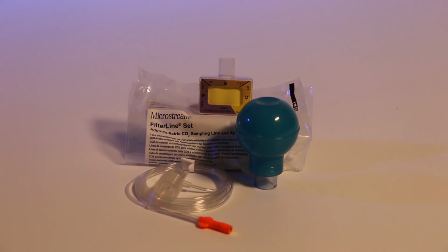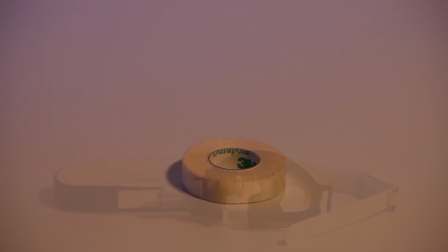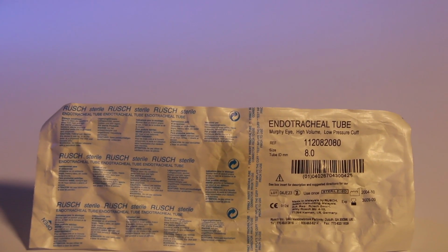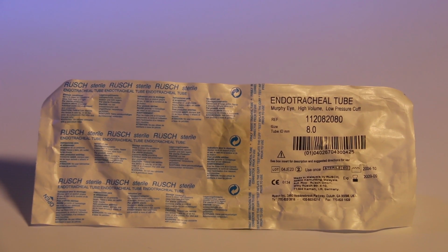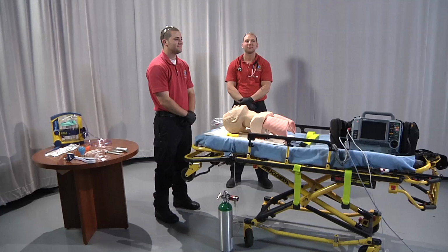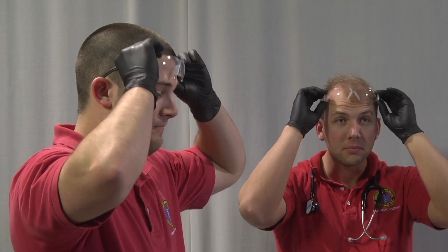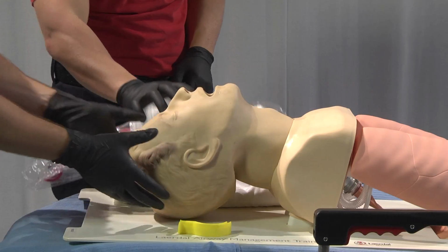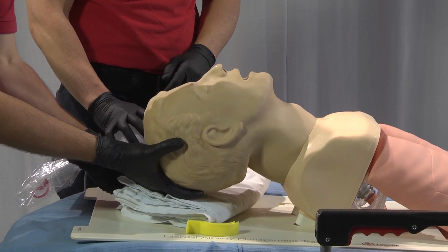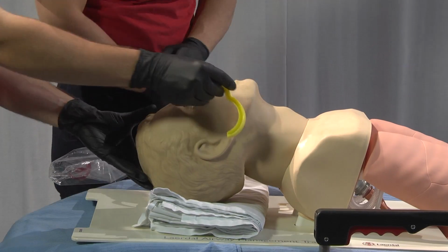Capnography device and a commercial securing device. Tape is acceptable if approved by medical direction. Special note, blade and endotracheal tube should be appropriately sized for the patient. Blade type is user's preference. Begin by taking appropriate body substance isolation precautions. Ensure your patient is being pre-oxygenated via bag valve mask with high-flow oxygen therapy and simple adjunct in place.